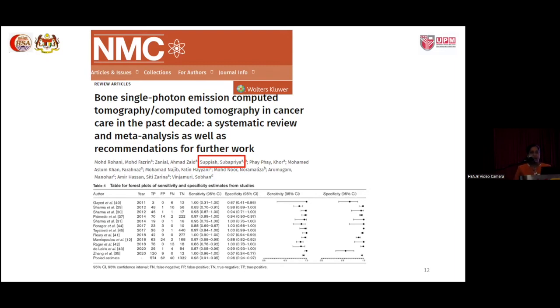And we have described, like how Dr. Shanmuga said, that in many Asian countries, vertebral uptake is commonly TB in origin. We have to look at the patient's history and the pattern of the CT bone lesion. This is one of the reasons for high false positives in bone scans, which you have to keep in mind in Asian countries that are endemic for TB. Also, we have to look at other patterns, like if it involves the pedicles, we are more confident of calling it metastasis.